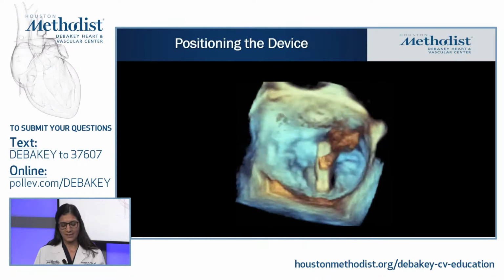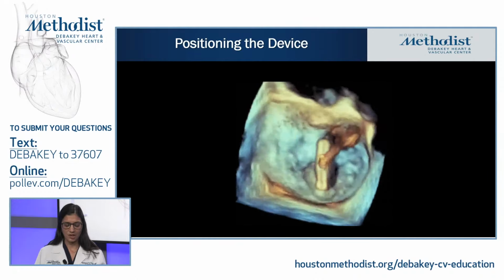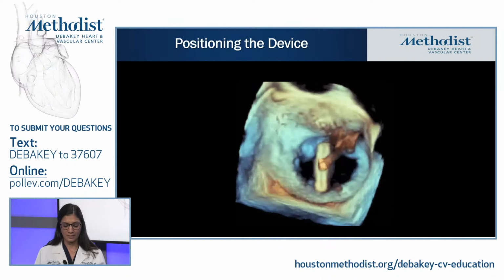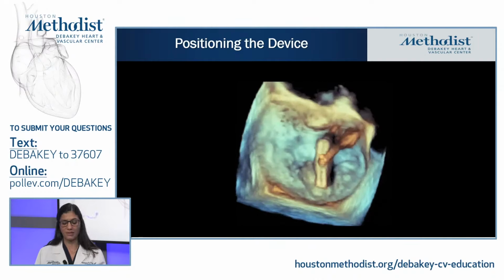You then advance the mitral clip, open it, and you want to position it right above that P2 pathology, because your target clip position right here is A2, P2, right above that P2 pathology. And again, 3D is very helpful in orienting and placing the device.